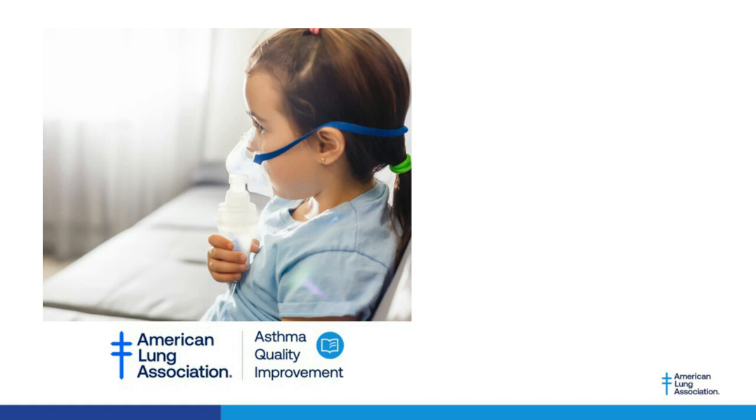Thank you, Ed. Next question coming from Michelle. How many puffs of the MDI do you suggest for the replacement of a neb treatment? The American Thoracic Society in 2005 suggested that we always give 4 puffs through the MDI. Now keep in mind, when you're doing a nebulized therapy, studies have suggested it's between 5 and 10 puffs through an MDI.